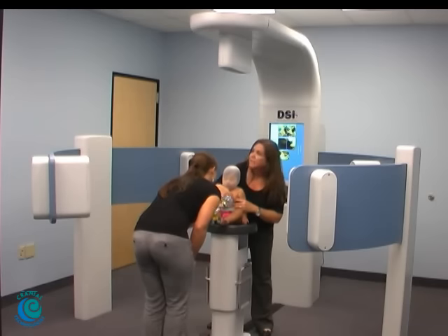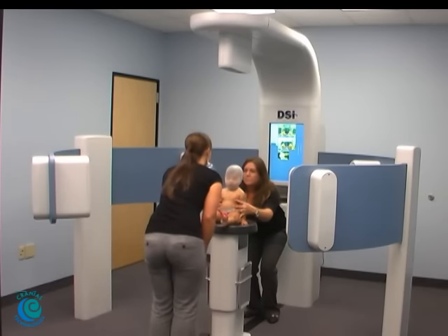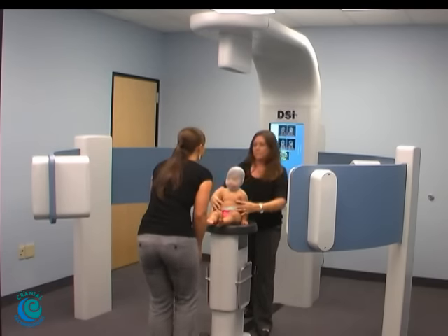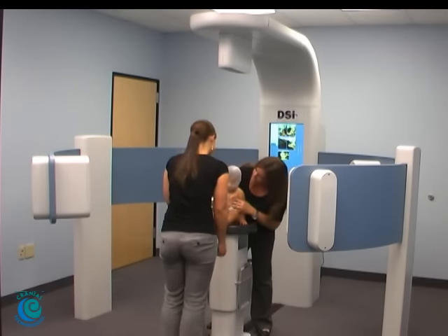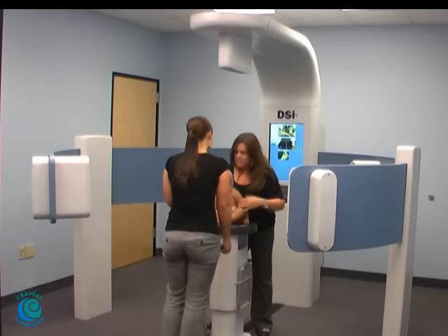Sophia, we're going to take a few of them just so that we make sure we have a good image. Let's see, sweetheart. Sophia, what's this, sweetheart? Oh, such a good girl.